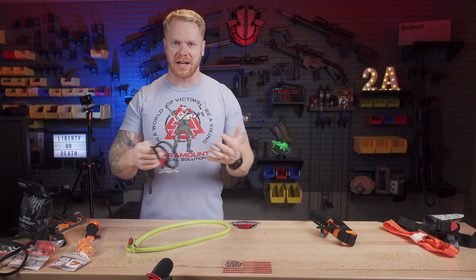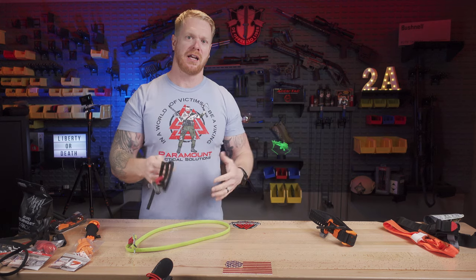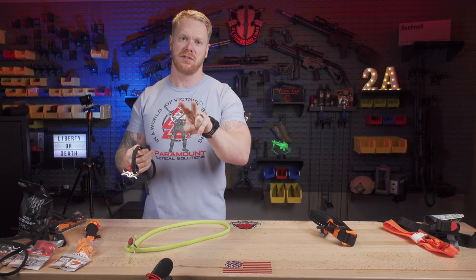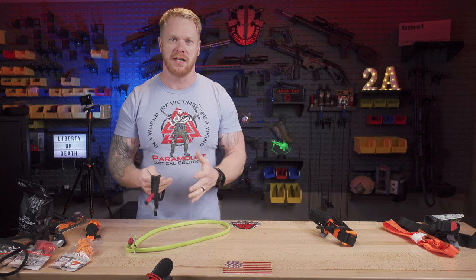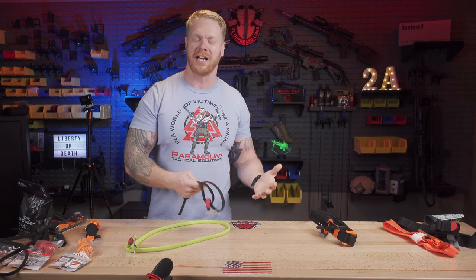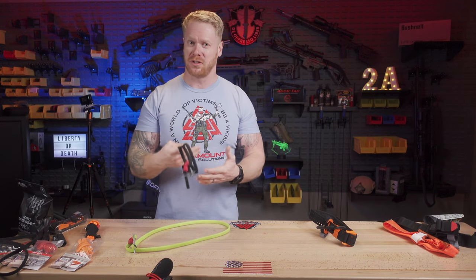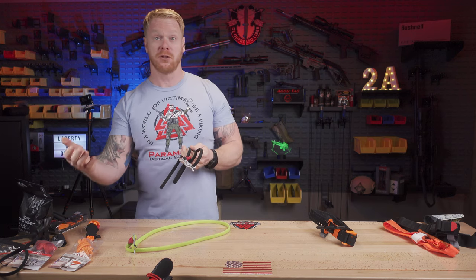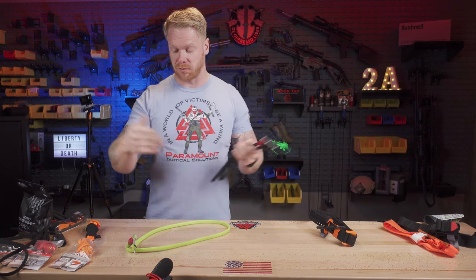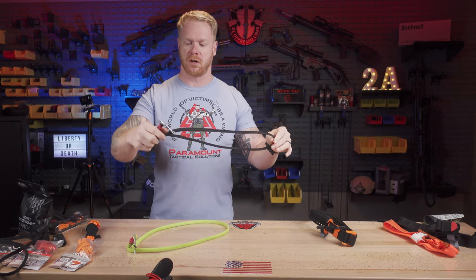I also want to say this video is not a substitute for training. I'm giving you some basic understanding of these two tourniquets, but that doesn't mean you're trained. You need to come get training with us or another reputable company so you can use these correctly, understand how to use them in context, and possibly save a life — as opposed to possibly doing more harm than good.